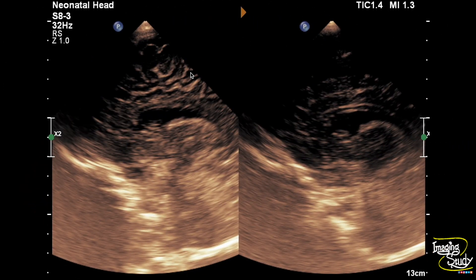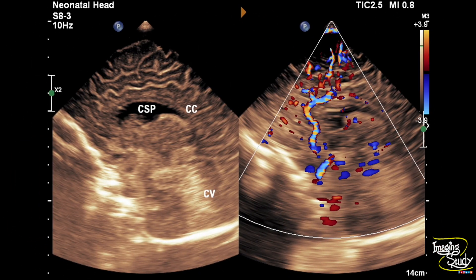Here are the sagittal sections and you can see prominence of sulci. We can see the corpus callosum, and on color Doppler you can see the anterior cerebral artery and the callosal branch. So we hope there is no corpus callosal abnormality.